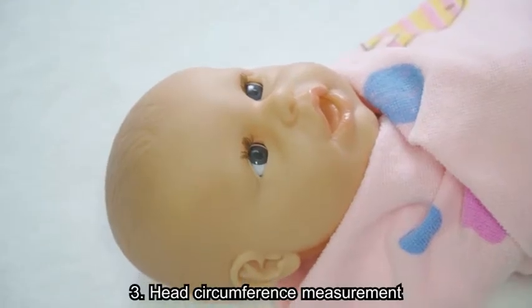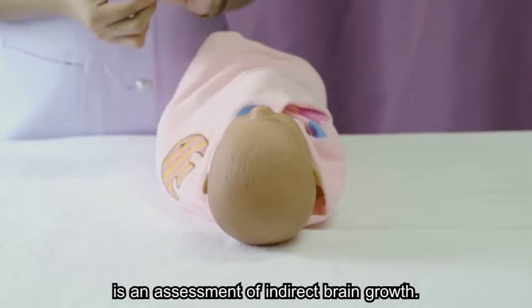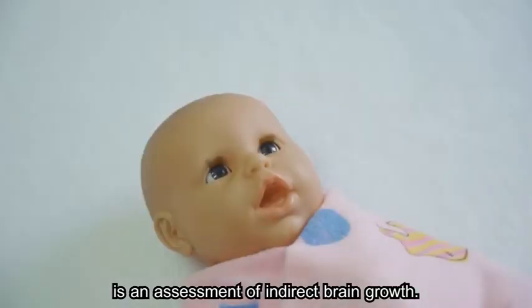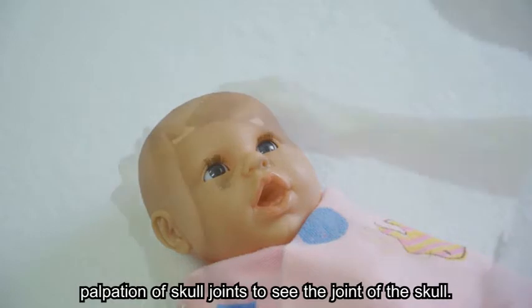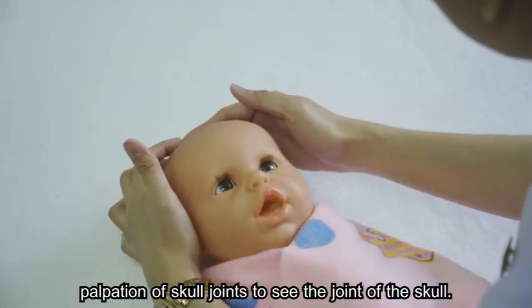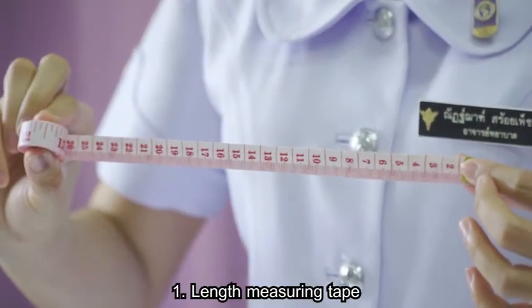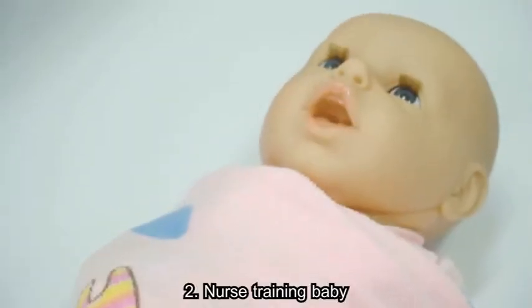3. Head circumference measurement. Measuring baby's head circumference is an assessment of indirect brain growth. Palpation of skull joints to see the joint of the skull. Equipment: 1. Length measuring tape. And 2.